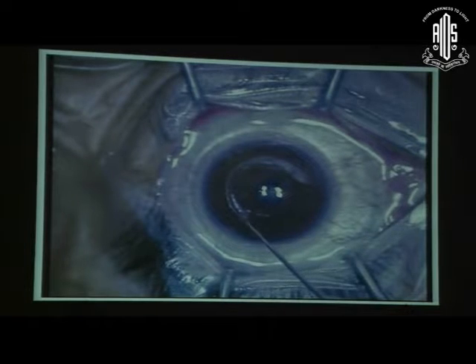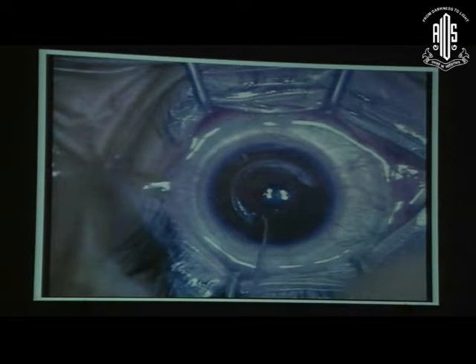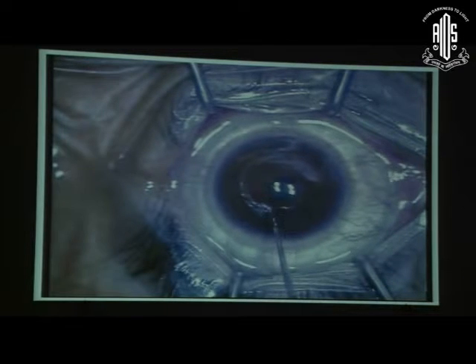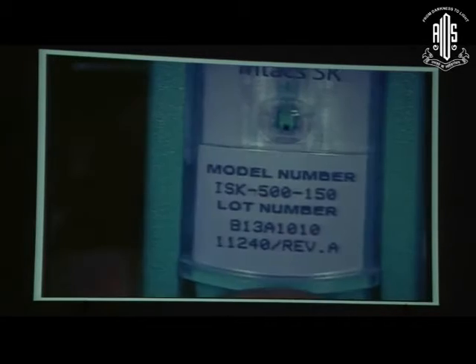And the best part with the femtosecond laser is that the depth is uniform across the cornea, as when you are doing it manually, sometimes there is a little hesitancy when you are working at a deeper plane. So sometimes you get an asymmetric depth. That means when you start, it's a little superficial, and on the later half, it's a little deeper. So here, the channel created is much better.